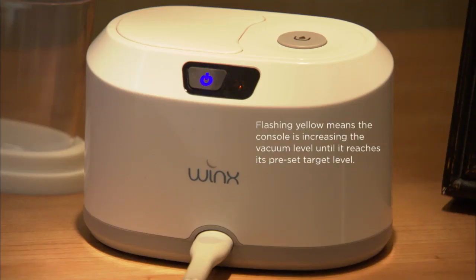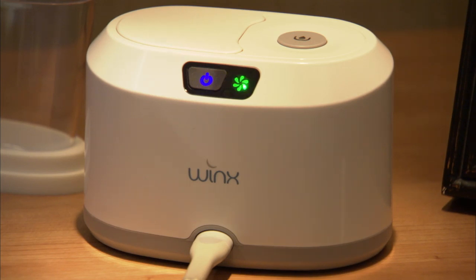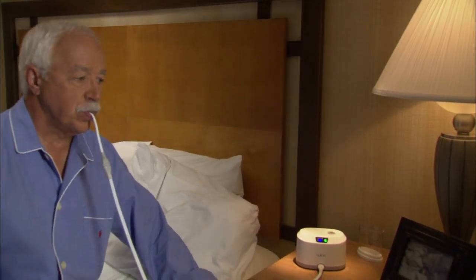To help achieve the proper vacuum, lift your tongue to the roof of your mouth and swallow. Wait for the flashing yellow vacuum level icon to turn solid green. This can take 10 to 15 seconds. When the icon turns green, you can relax your tongue. The vacuum will hold it in place.